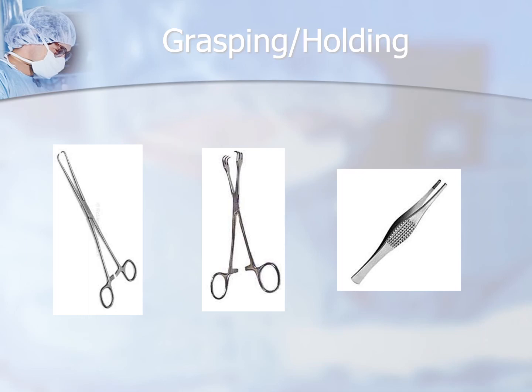Moving on to grasping and holding, we've looked at a variety of grasping and holding instruments like the Allis, the Kocher, the Babcock, and some that we might not have looked at yet. The single-tooth tenaculum, the first one on the left, is used for grasping and holding the cervix when we're doing D&Cs or something of the sort. The middle one is called a Lahey clamp. It is good for when we're removing biopsies from the breast or something like that. And then we've talked about a variety of different forceps. This one happens to be a Ferris Smith forceps.